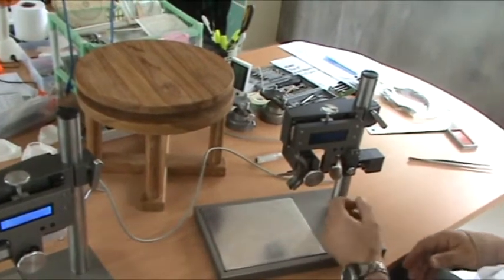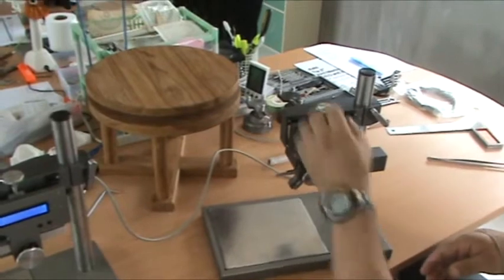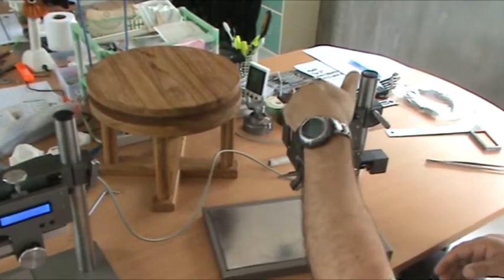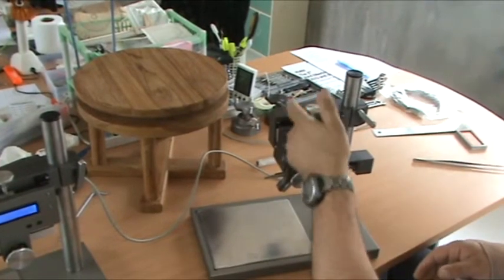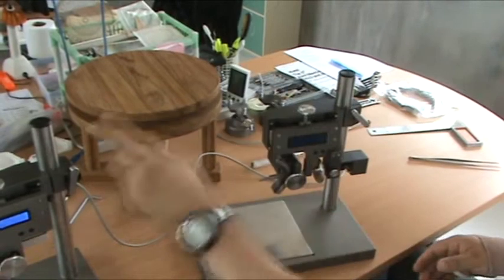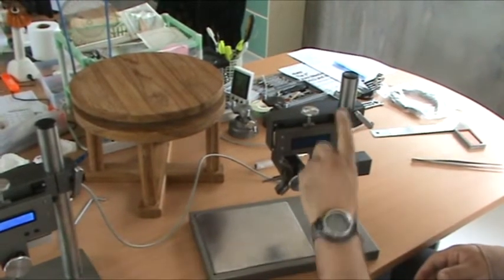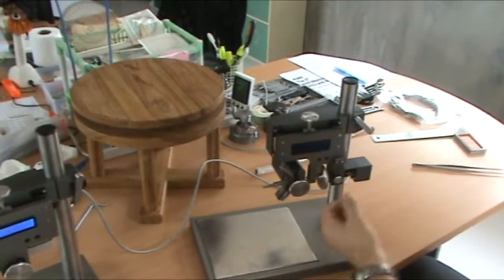The same thing is here, we need to unlock. I will have locked this, wound it up, so this can go up and down. There's no measurement for this. This is just for working. This is just a fine height adjustment, but it doesn't measure anything like the other instrument. This just facilitates our working procedure.